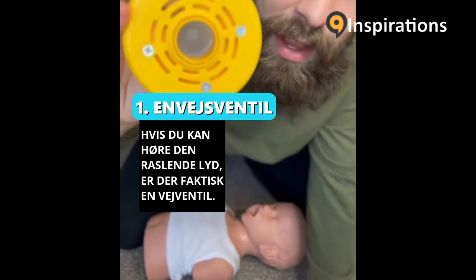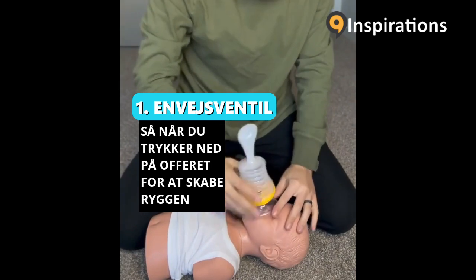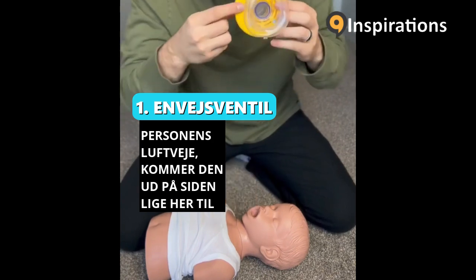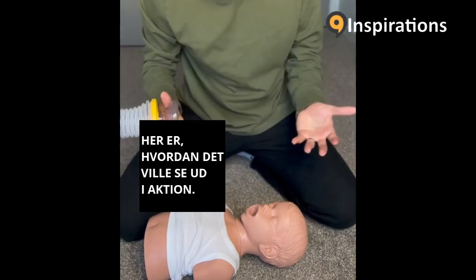If you can hear that rattling sound, there's actually a one-way valve. When you push down on the victim to create the back pressure, the air instead of going down through the mask into the person's airway, it comes out the side right here to create the back pressure. Here's what that would look like in action.